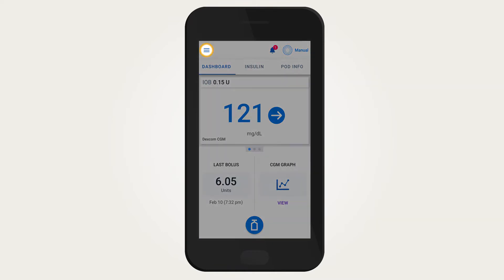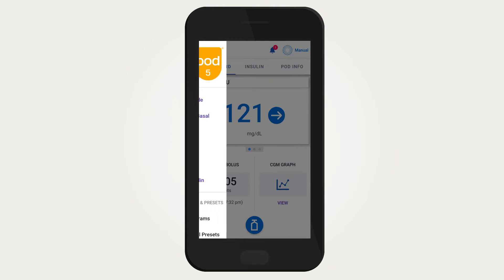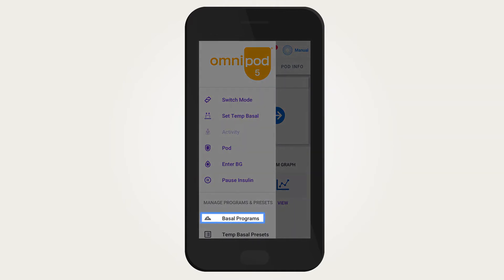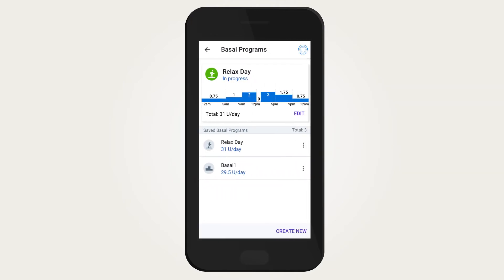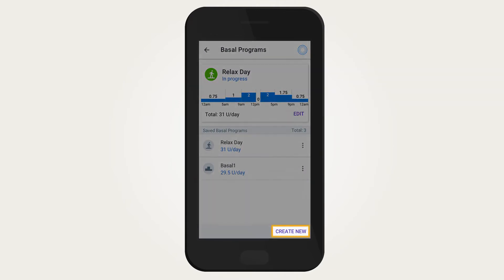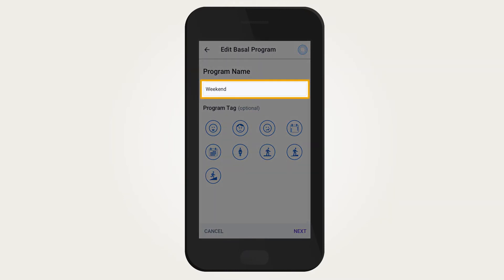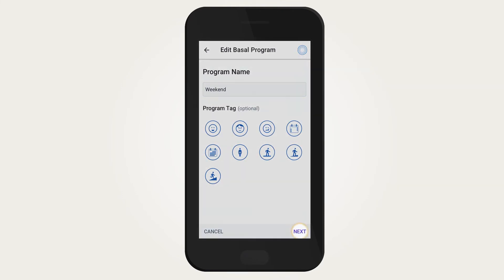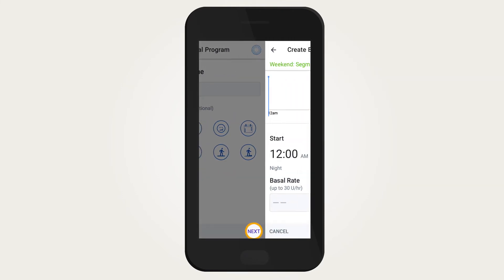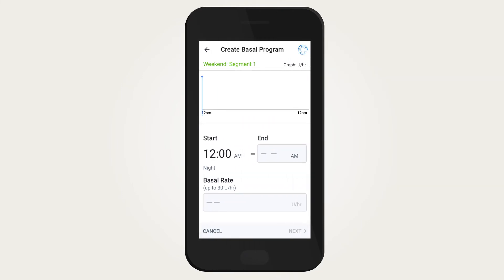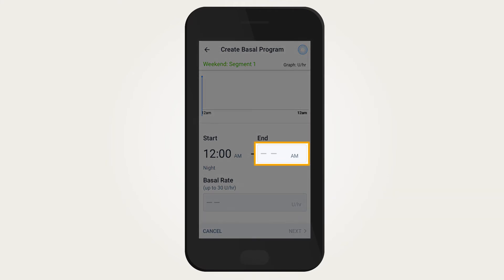To create a basal program, the system must be in manual mode. From the home screen, tap the menu button, tap Basal Programs, tap Create New, then tap the program name field to name the basal program. Select an optional tag and tap Next.